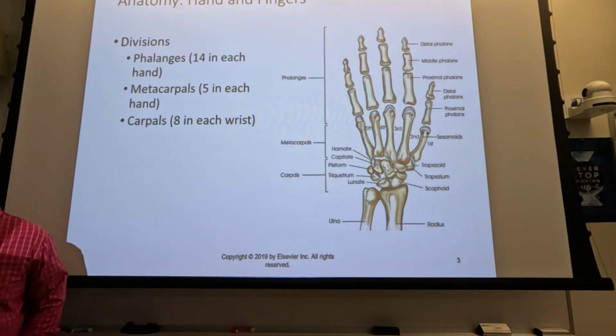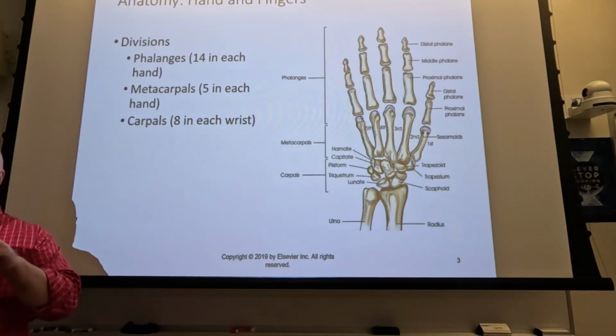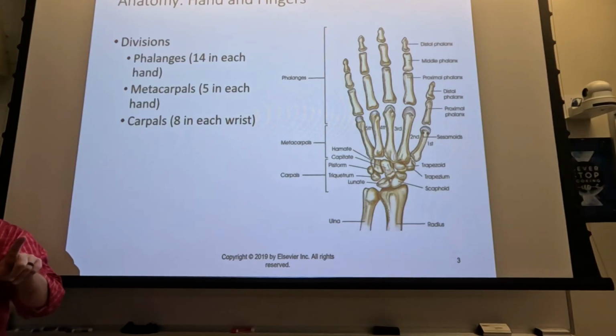And the purpose for the ½ inch beyond the skin line is because your collimators can be off. They can misrepresent the radiation field. So if you collimate to the skin line, let's say you're doing an individual finger, how much soft tissue do you have past your bone on your fingers? Not much. I mean, your finger's only an inch wide, so if your collimators are off by ½ inch, and you collimate all the way down to the skin level, you got a problem, right? You're going to miss anatomy. You're going to have to go back and reshoot it. So your collimation is going to be to about a ½ inch from the skin line at the largest.